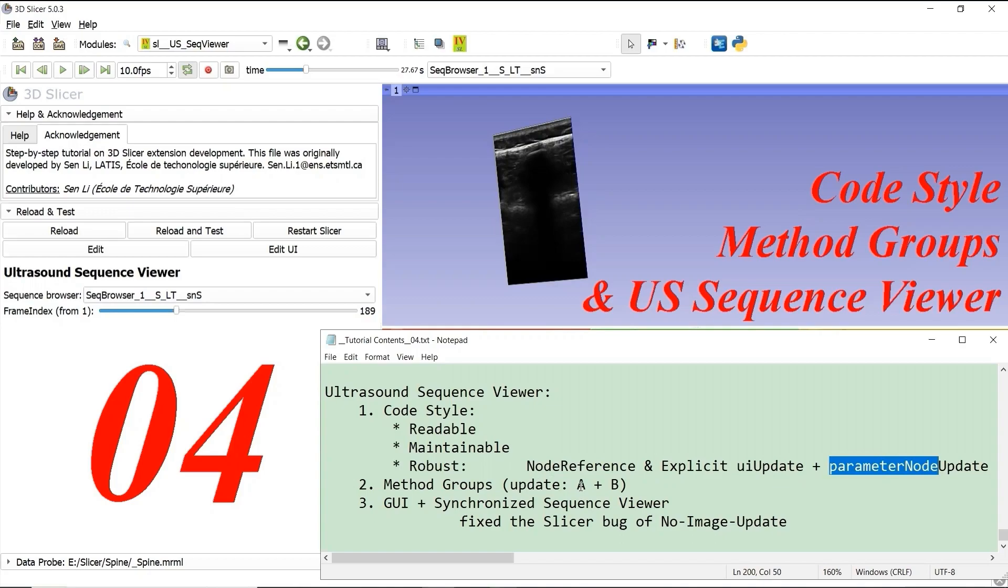Using two groups, group capital alpha and group capital beta, for the update of user interface and parameter node, we can put similar functions together for better code reading and programming. Note that we can connect signal slot when we edit the graphical user interface.